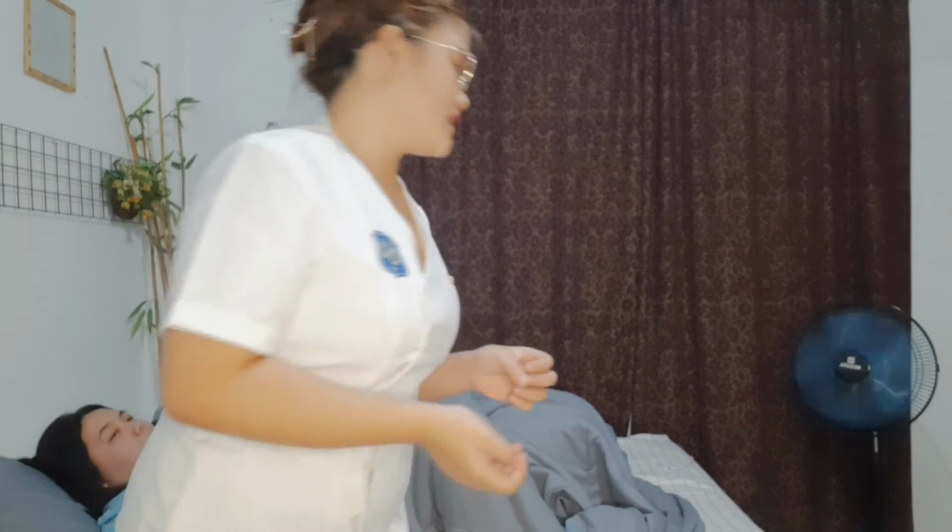What is the rationale of that? It is to relax the muscles and allow visualization of the urethra to facilitate insertion of the catheter. Then, after that, you need to drape the client's abdomen and thighs.